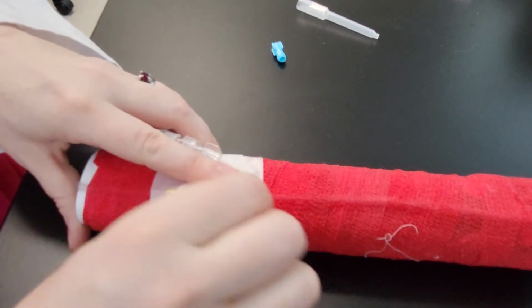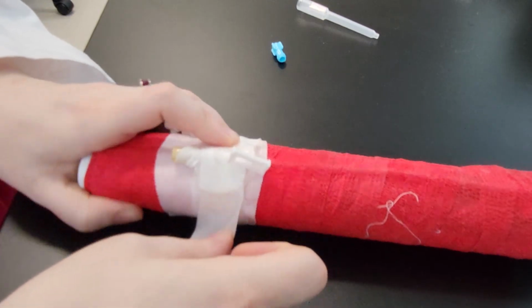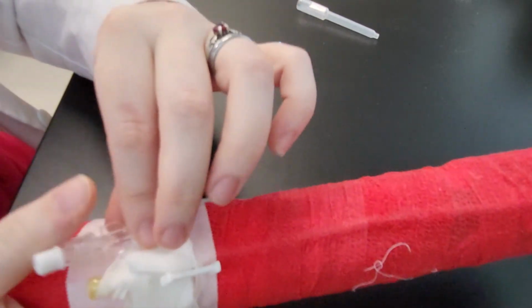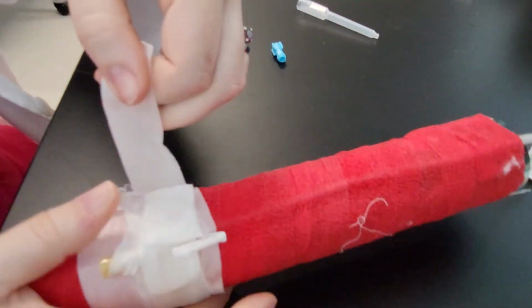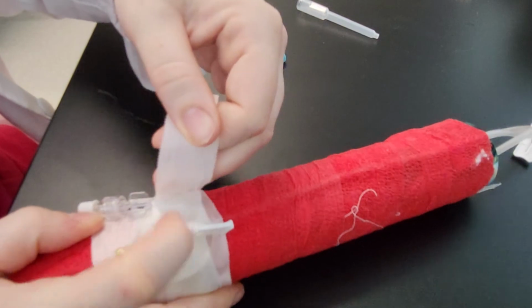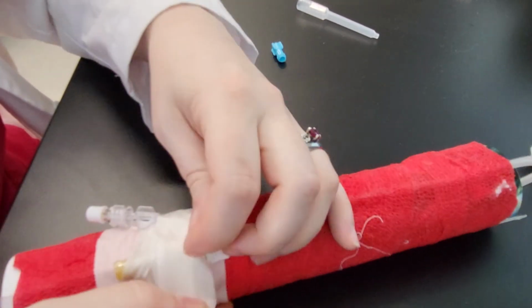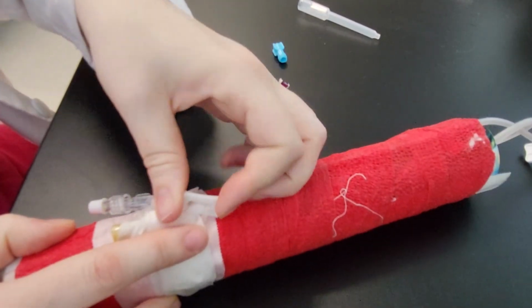You want to make sure you leave this outside of the tape. If you tape that in, you're not going to be able to clamp and unclamp. So you want to make sure that that is out. At this point, I'm going to wrap everything all the way around the leg. And I'm going to tape down straight over everything else and then pinch everything down.